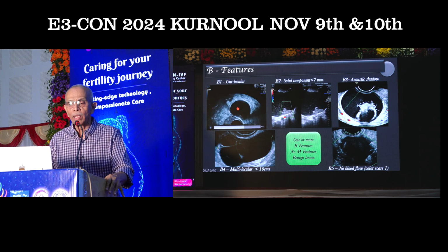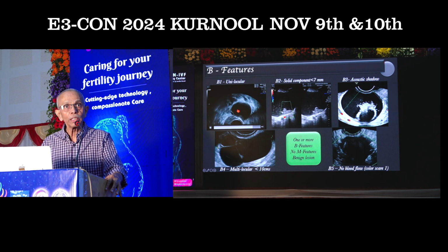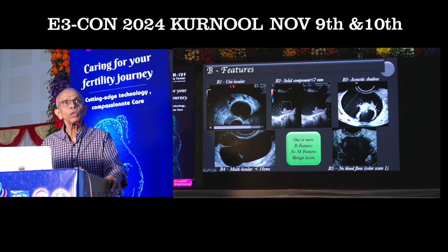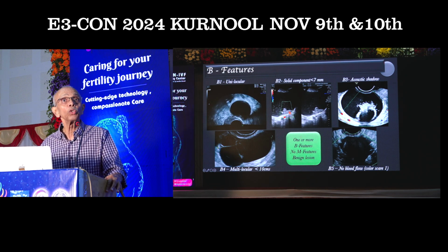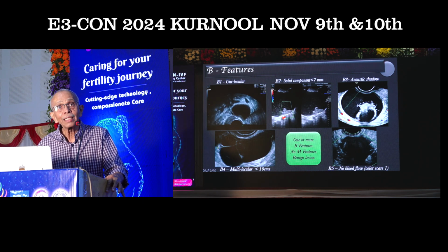This is a classical one. Here we have B features from B1 to B5. Whenever we have a unilocular cyst which is well circumscribed, the internal wall is absolutely clear, there is no solid component, and it is less than 10 centimeters in diameter, this is what is called the unilocular cyst, which is B1. Then we have a small solid component which is called an irregularity. When I showed you the papillations within the cyst, a small projection like this is not called a papilla, it is called an irregularity.